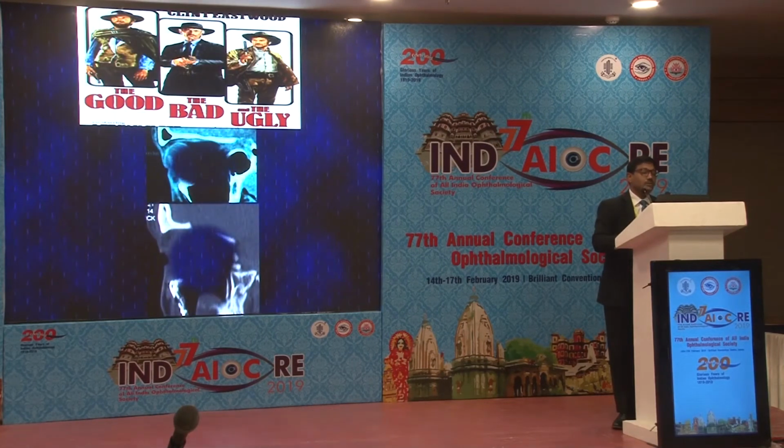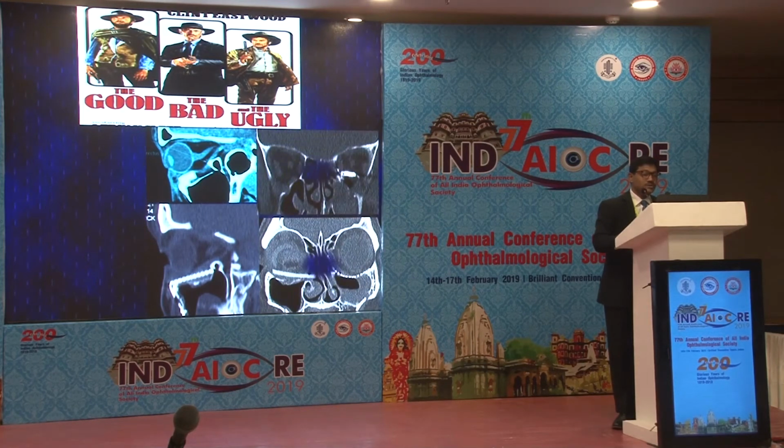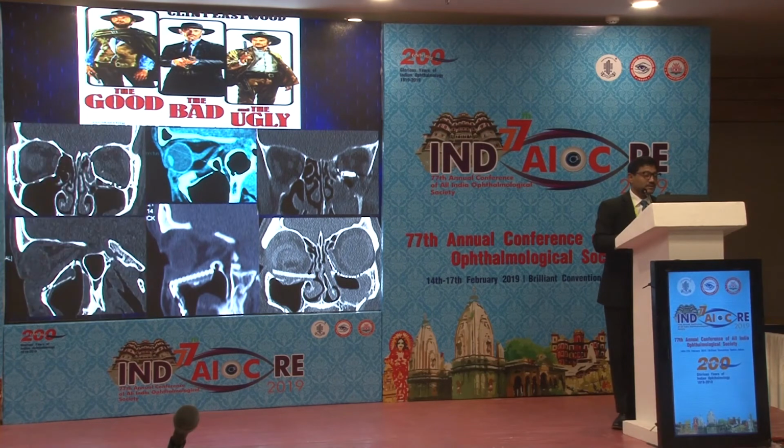So I like the good, bad, and ugly concept, and the movie as well. Keep watching it 100 times and still can watch it again. Examples of badly placed implants, the wrong implants, worsely placed implants where the implants are in the sinuses, and what you really want to chase is a good implant.